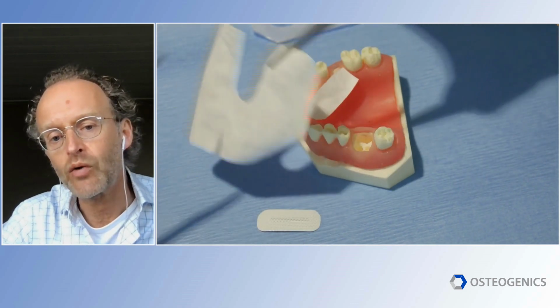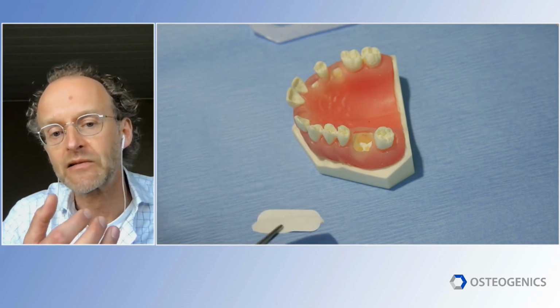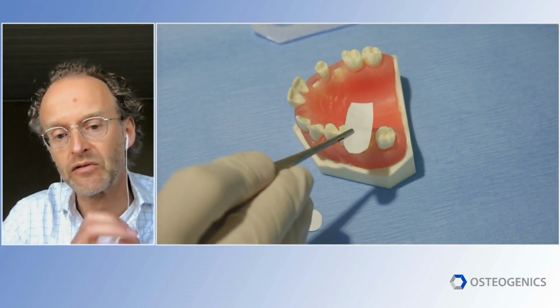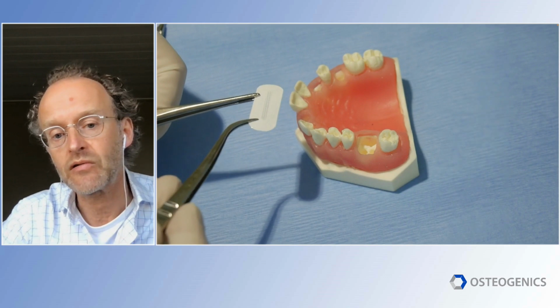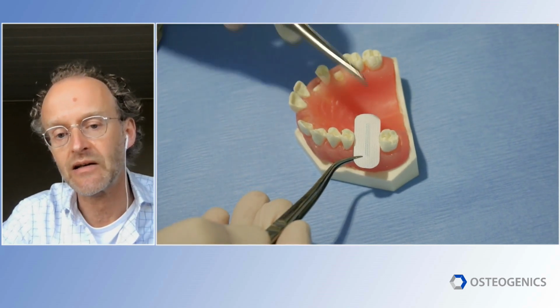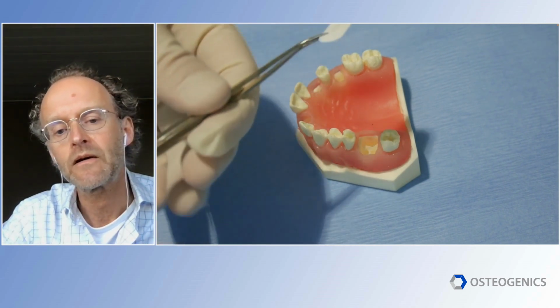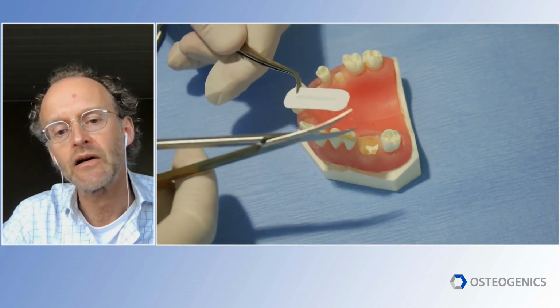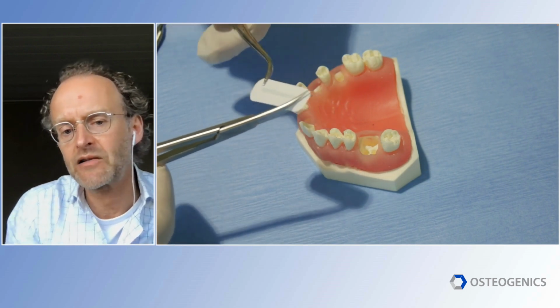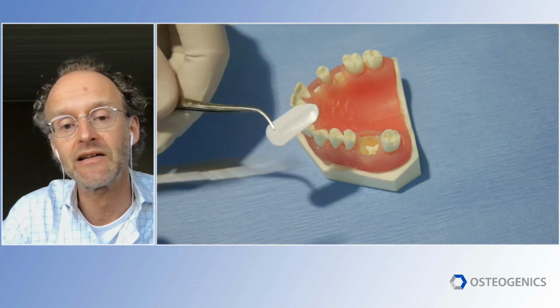If you start working with this technique, you can, of course, with the paper first make a template when you cut the membrane to the right size. But you can also directly cut it. And then you're going to have a look and see now it's too tight. There is not enough space. So first, I always start cutting a point, kind of point shape from both sides to get it easier in the deeper part.